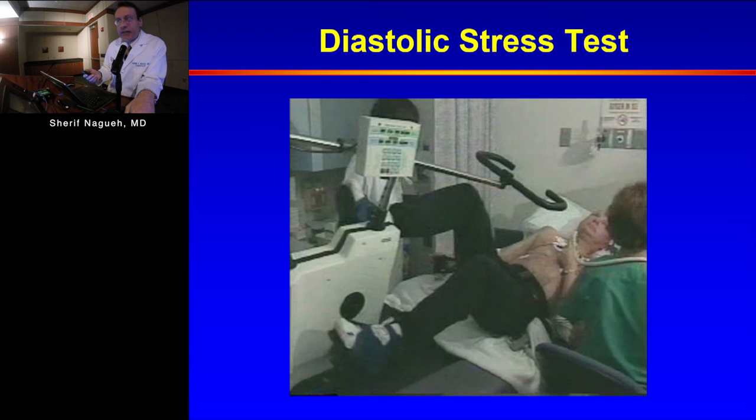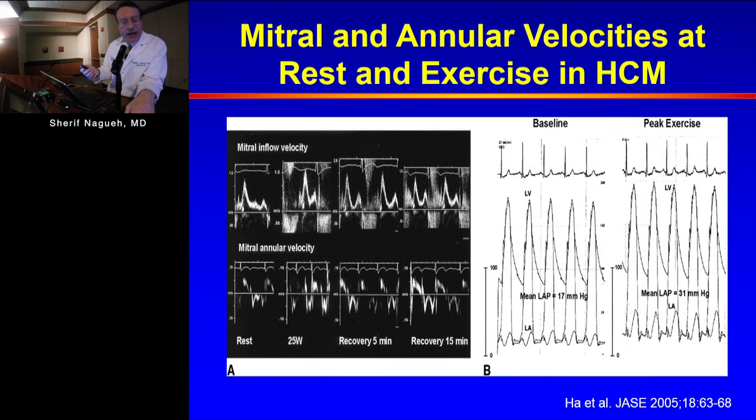Can we do a diastolic stress test? Yes. There is interest in the diastolic stress test, but there is little data in terms of large series. Most of what we have are small observational validation studies. This is the earliest publication from the Mayo Clinic. They took a patient with hypertrophic cardiomyopathy and they tried to predict what happens with the left atrial pressure with exercise. Let's look at the cath recordings first, and then we'll look at the Doppler recordings.